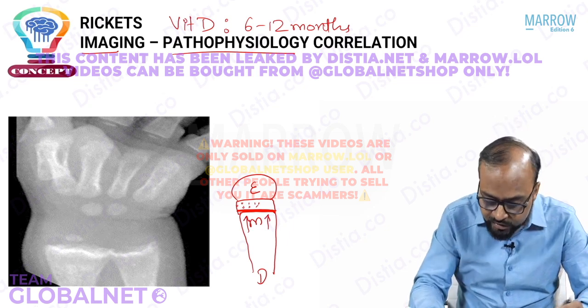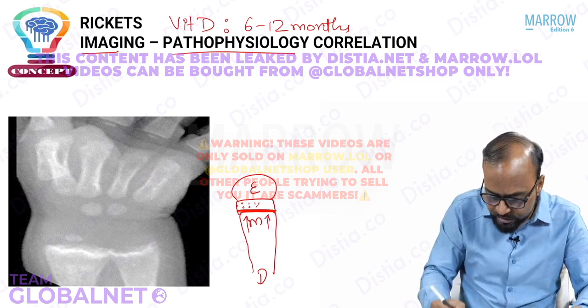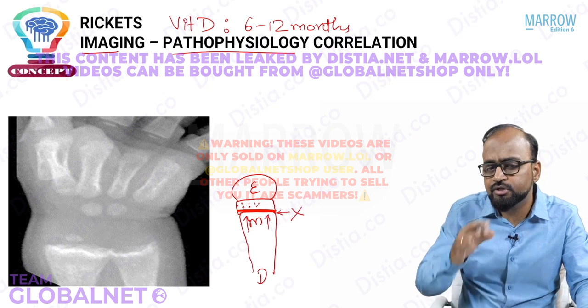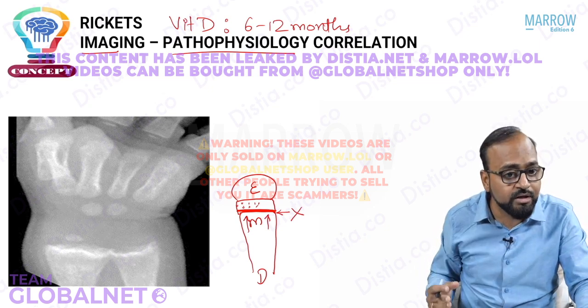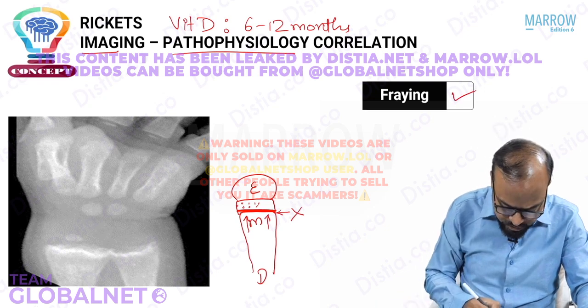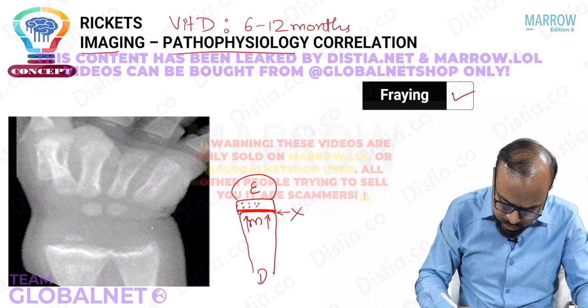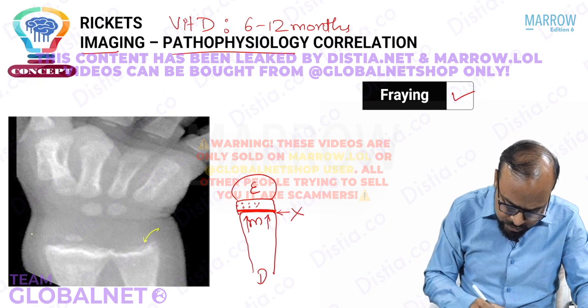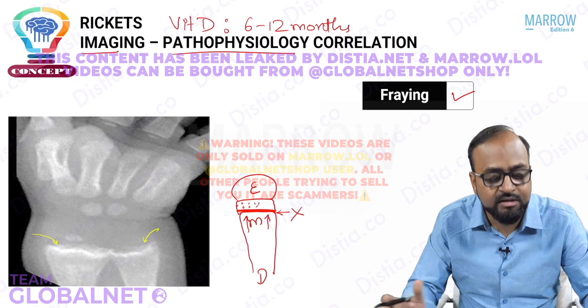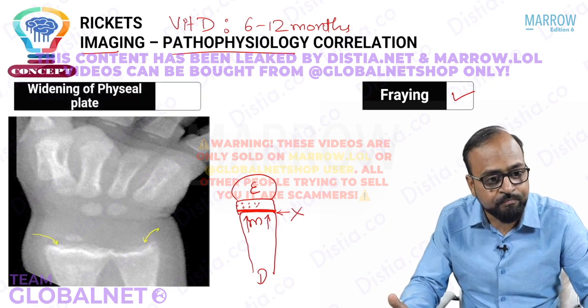Now when vitamin D is not available, this calcification of the metaphyseal margin will not occur, and so the metaphyseal margin or edge becomes extremely ill-defined or blurred. This is what is called the fraying of metaphysis. So look at this image here. In this image, the margin of the metaphysis has become extremely blurred or indistinct. This is what is called fraying.